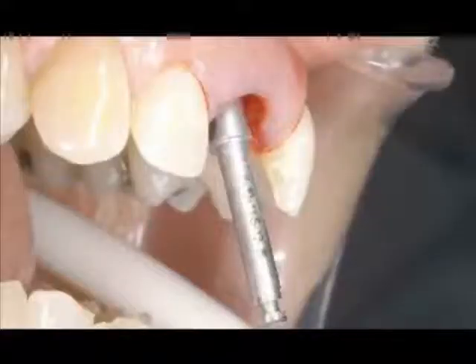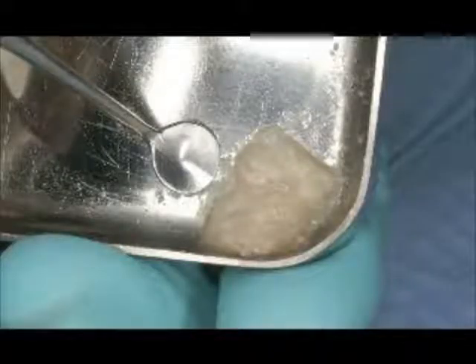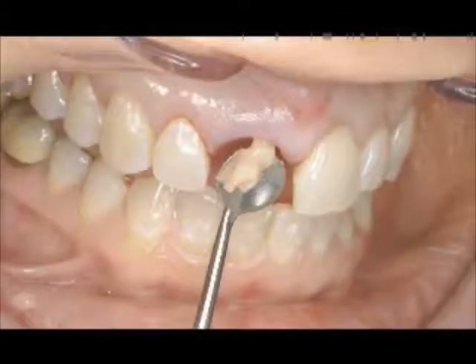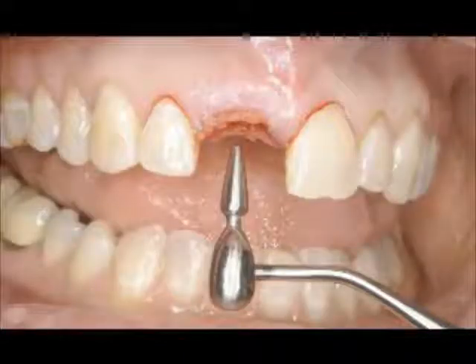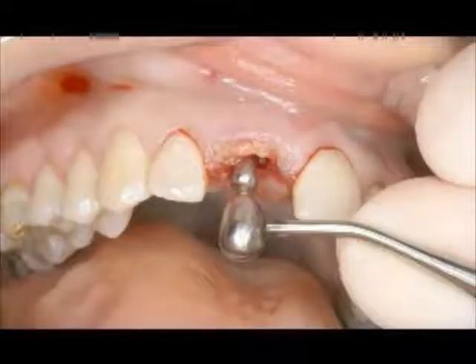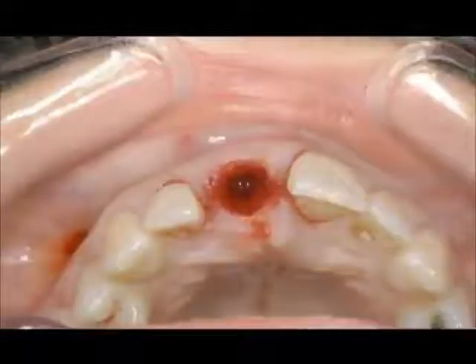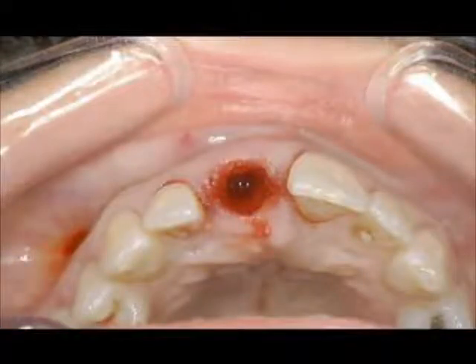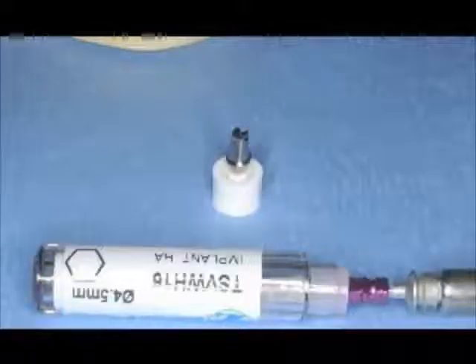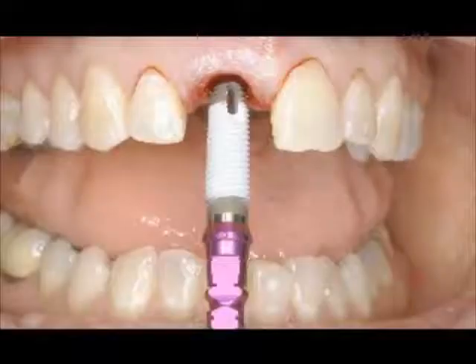It's going to be a 4.7 by 16 millimeter implant, and we harvest the autogenous bone from the drilling sequence and utilize that bone to graft the space that we had left on the buccal axis. So this is internal socket grafting. We pack this bone, autogenous bone. You can also use mineralized allograft bone if you'd like. And you can see we've packed this bone only against the buccal wall, that area that had not been engaged during the drilling sequence. Now proceeding with implant placement.